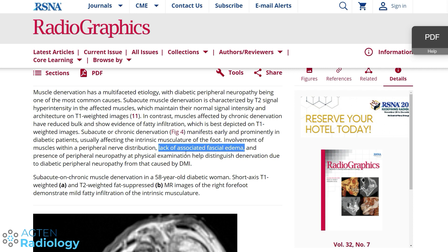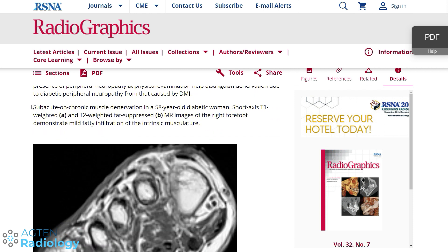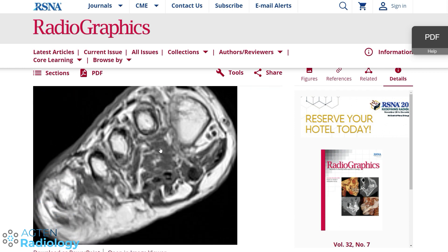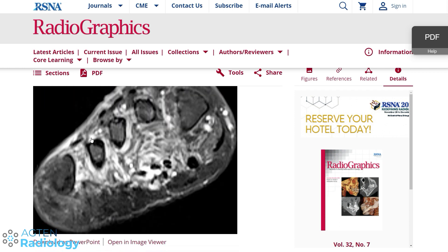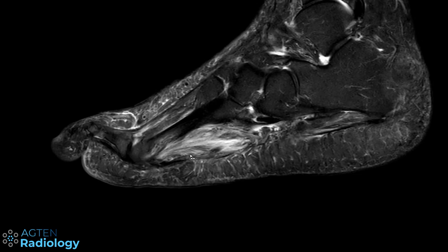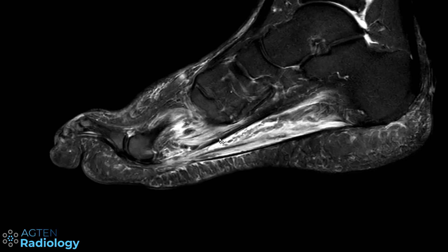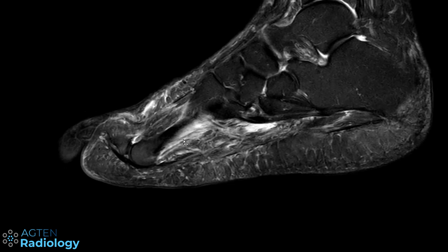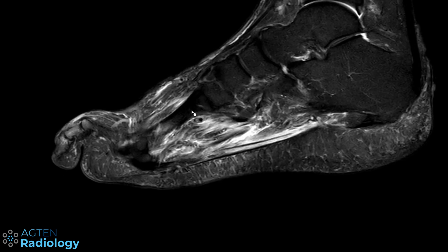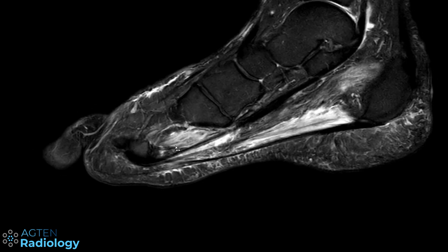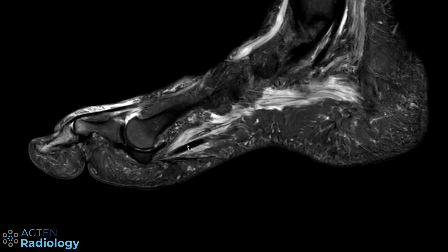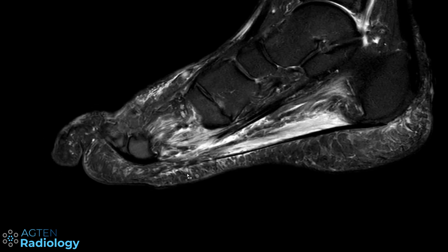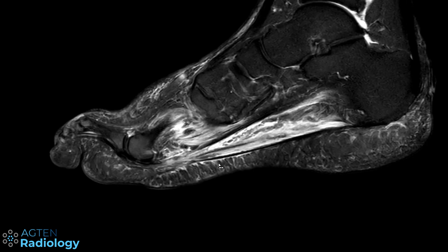There is no fascial edema and no abscess formation, so this is basically the example shown in the article: subacute to chronic muscle denervation in a diabetic patient. You can see there is generally a bit more fatty infiltration than we want, and a lot of muscle edema. Sometimes it's subtler, and sometimes if you don't have the full history, it can actually be an indication that the patient has diabetes — and it seems to be present before the clinical symptoms of a proper polyneuropathy, according to the article.